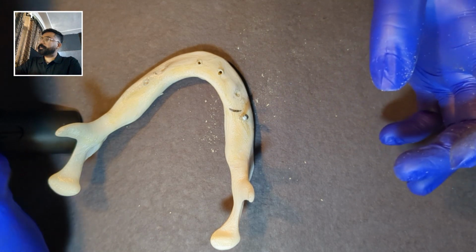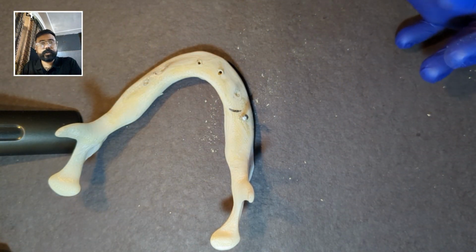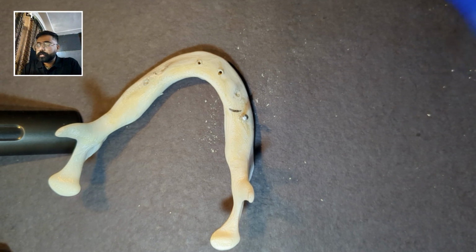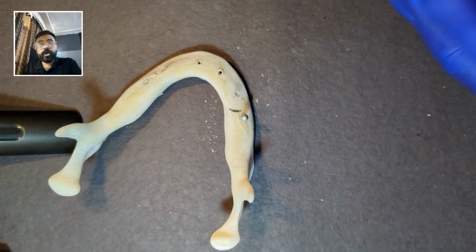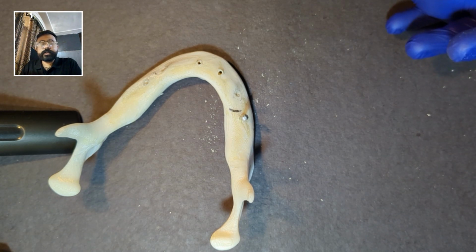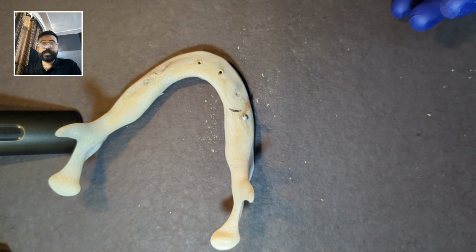This technique is primarily used to replace the mandibular molars, first and second molar, primarily the first molars. This technique can be used as a standalone technique, like replacing a single tooth or segmental replacement, or even in case of full mouth rehabilitation, we can place two lingual cortically engaged implants on the right side, two lingual cortically engaged implants on the left side. This is how we do full mouth rehabilitation in basal implants.